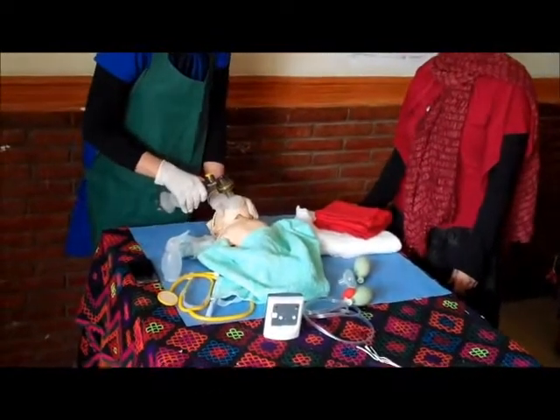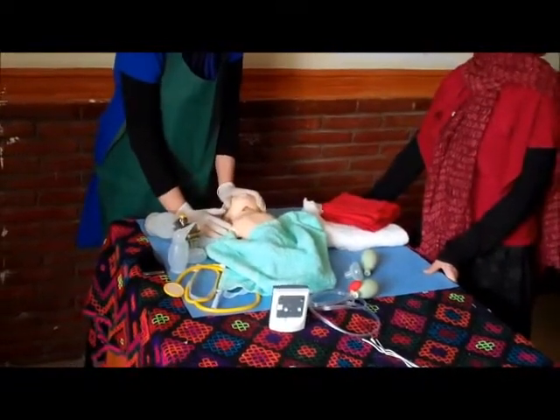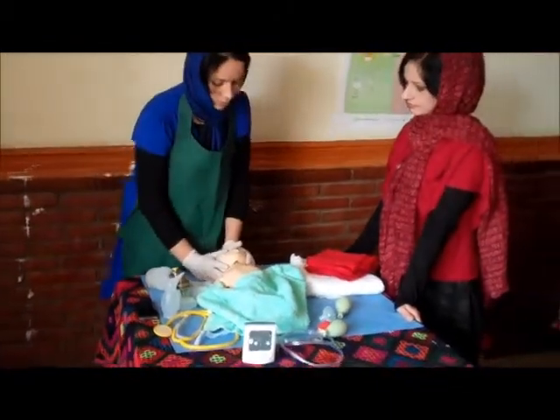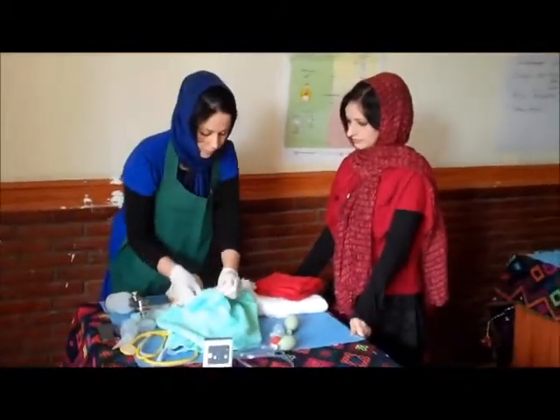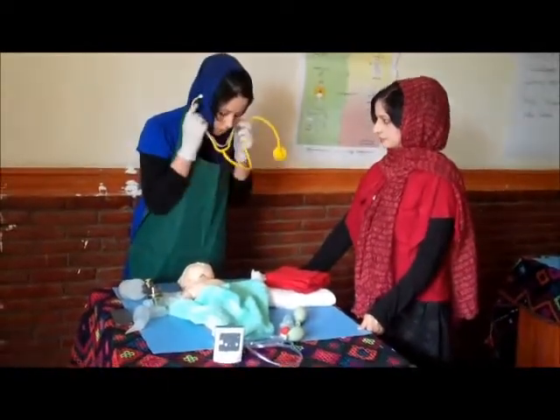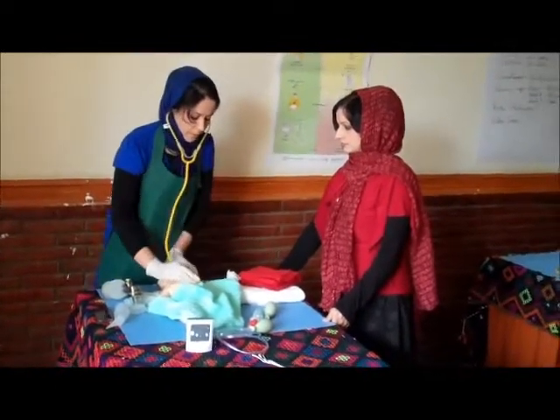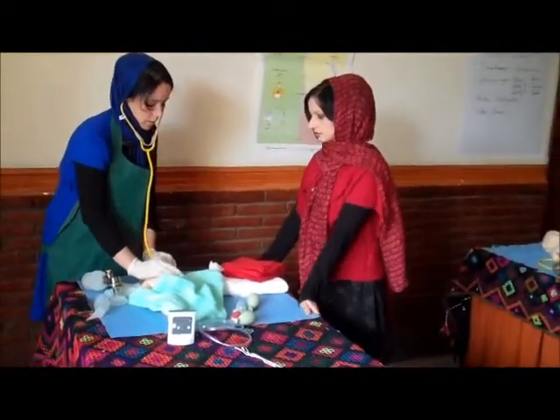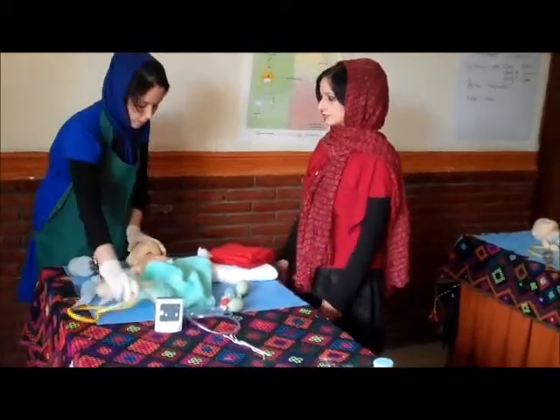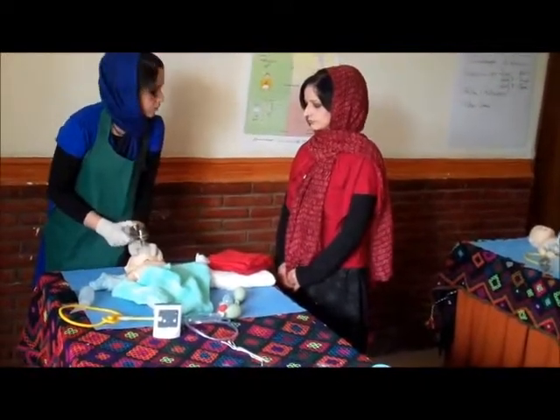When the baby is still not breathing normally, we should call for the pediatrician. We can also check the baby's cord pulsation and use the stethoscope. The heart rate should be about 100. We can try ventilation again or provide oxygen.